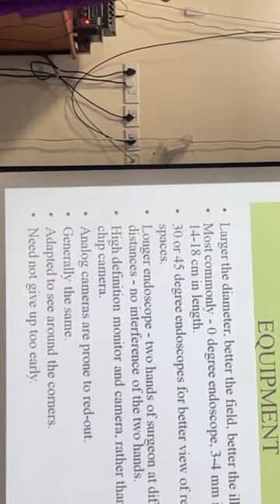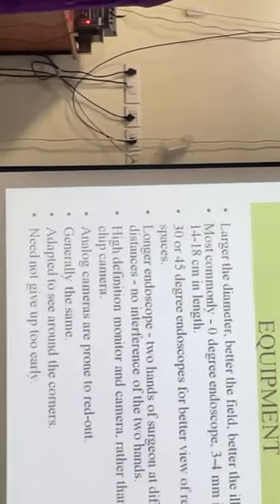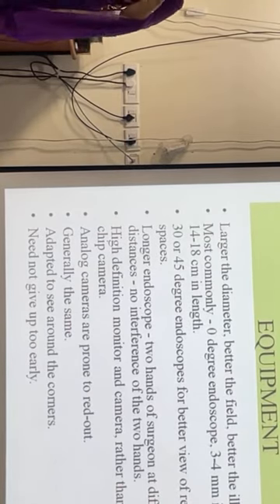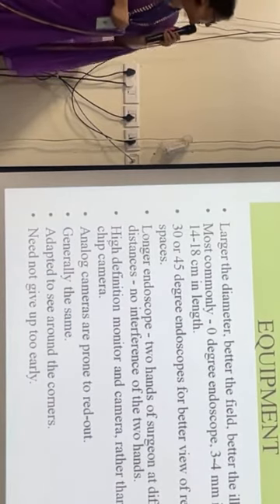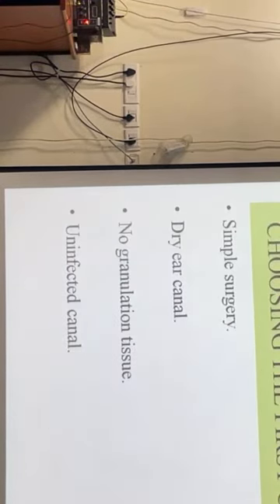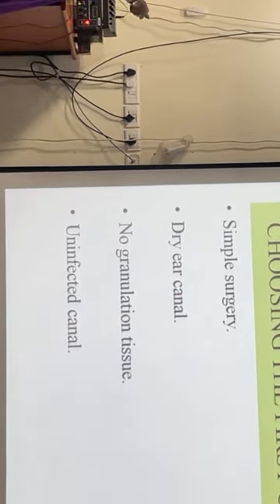We are adapted to seeing the corners. Sometimes when we are giving the tympanomeatal incision there may be bleeding, we don't have patience, we don't use an adrenaline soaked swab, the canal is narrow, and we abandon the approach, saying there is bleeding, and quickly shift to the post-auricular approach. Here our patience is tested, and we should wait and have patience. If we have to start with endoscopic surgery, we should choose a simple surgery at first, a simple myringotomy or maybe a wide canal type 1 tympanoplasty. It should be a dry ear canal with no infection, so that there is less bleeding.